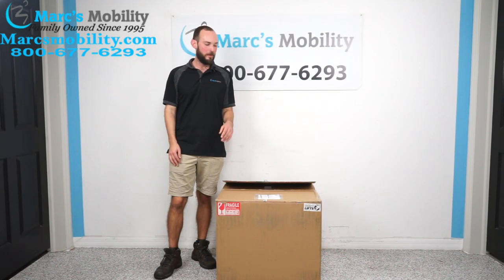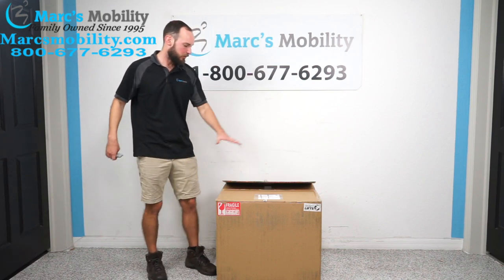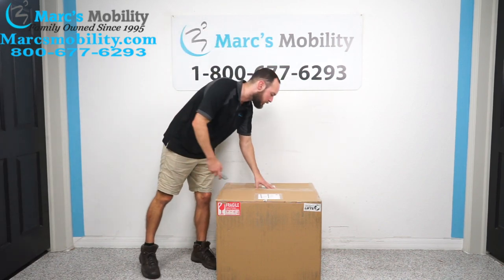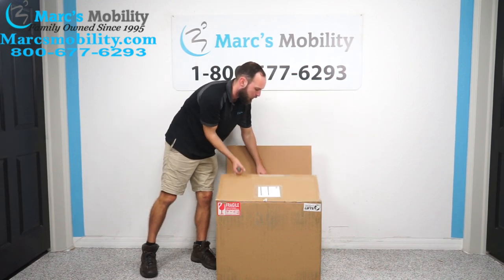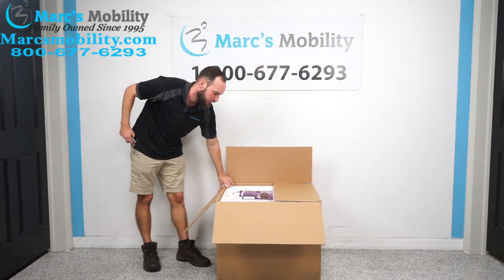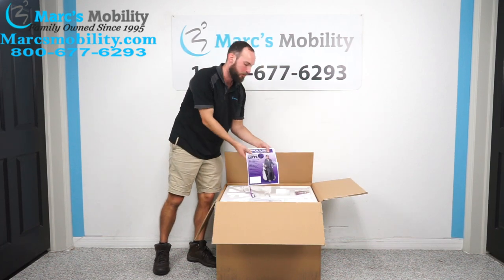Today is the unboxing of the DL-Lift DL-1 Deluxe Toilet Lift. We're going to start with this box here and cut it open. The first thing that we see, we have a little product insert.